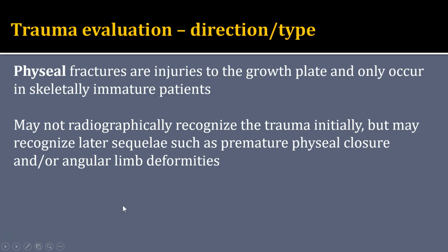So whenever I have a skeletally immature patient who has had some sort of trauma to their musculoskeletal structures and we radiograph them, if I don't find a problem at the level of the physis, I still like to discuss the possibility of growth plate injury with the client so that we can have the client watch the patient closely to make sure the limb is growing as expected. And then we might even consider bringing the patient back in for recheck radiographs in several weeks to see if we can identify the problem later.